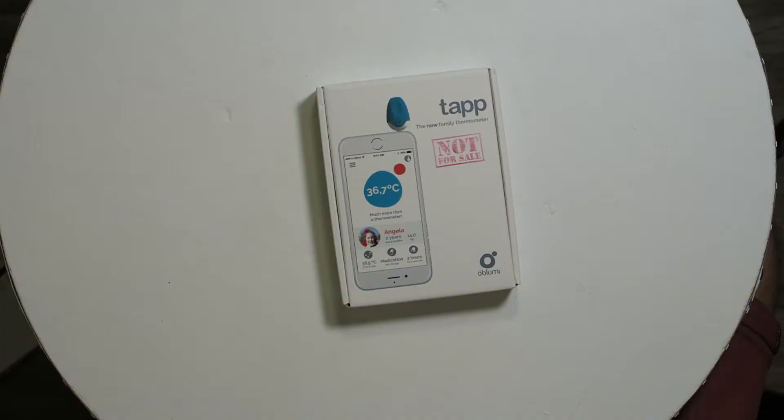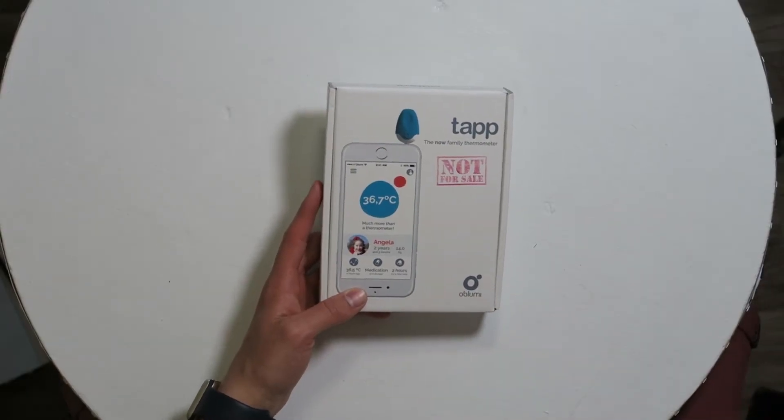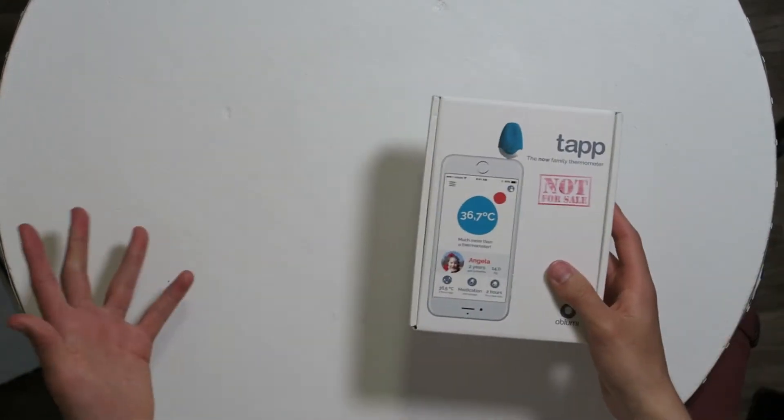Hi, I'm Simon from the Red Ferret. As you can probably tell, it's smoking hot outside, so the perfect opportunity to review a tap thermometer for your iPhone. This little device is called the Obloomy Tap — it's an infrared thermometer for your smartphone. Let's check it out.